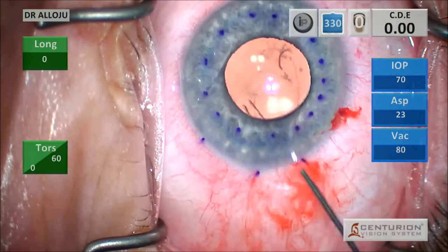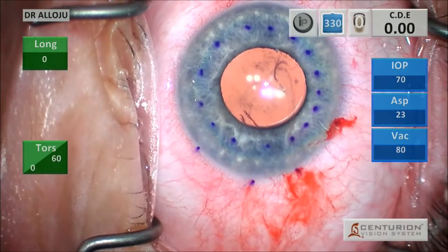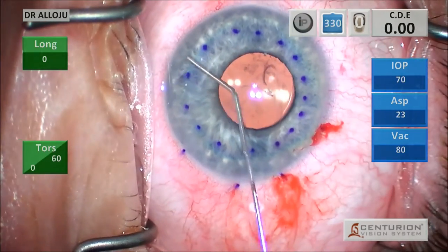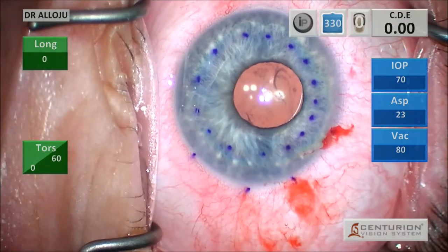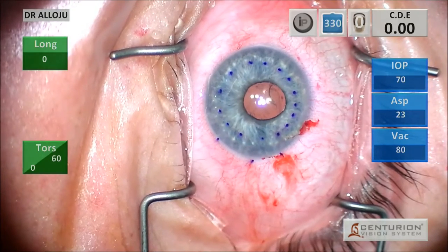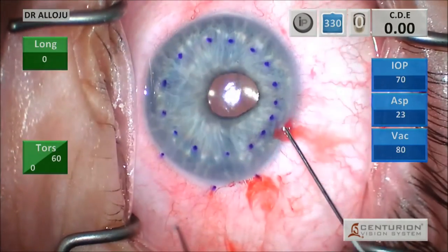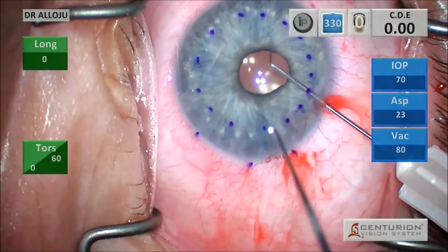Next, I basically perform my peripheral iridotomy inferiorly. And I do this by injecting some viscoelastic, ProVisc, to kind of elevate the iris. And then I use a little bit of local Miochol. As you can see, I really injected it just inferiorly where I want it to. You don't want to inject it all over because you've still got viscoelastic that you need to get out of the eye. But I feel like the step is safer here with some viscoelastic still within the eye.